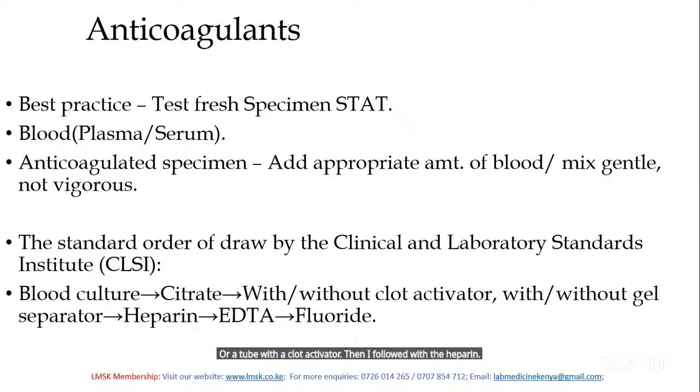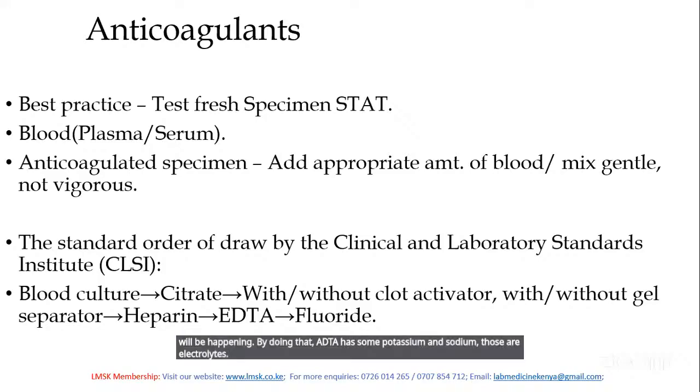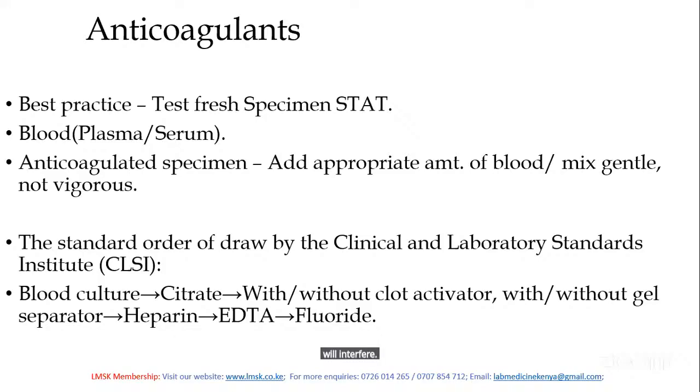There is heparin and EDTA. If you interchange EDTA, then heparin, you can transfer some EDTA into the next tube, which will be heparin. EDTA has some potassium and sodium. Those are electrolytes, and they will interfere with the plasma in heparin if you are to analyze for electrolytes. That's why you start with the heparin, then you go to EDTA.